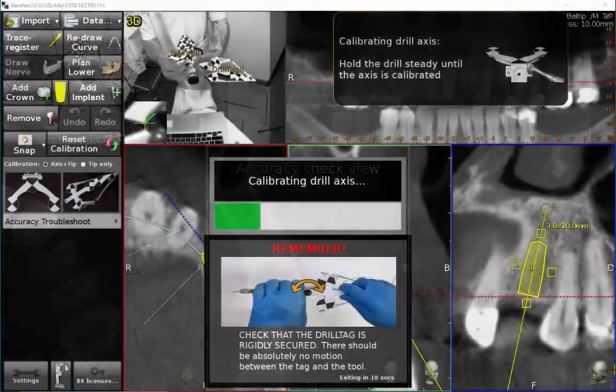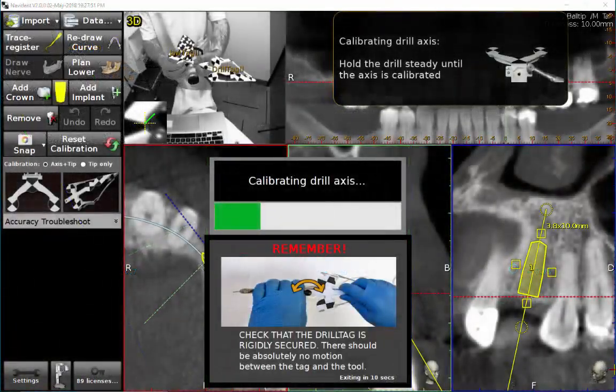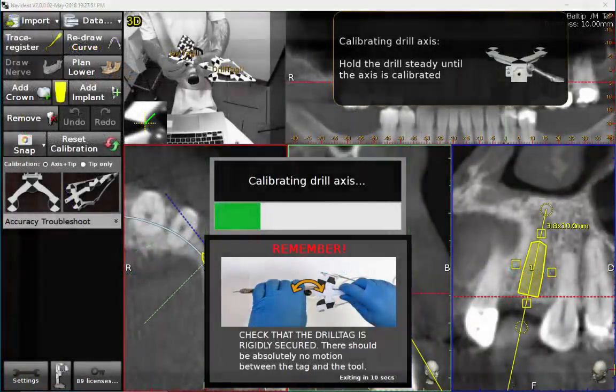After the registration accuracy has been verified, we can proceed to the surgical navigation, starting with drill calibration as usual.